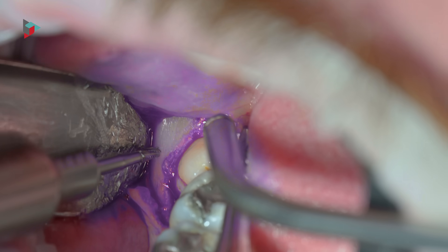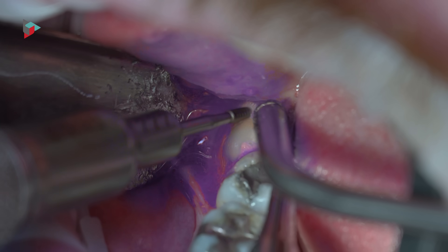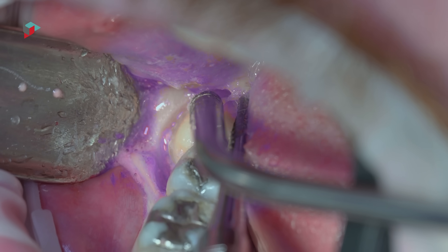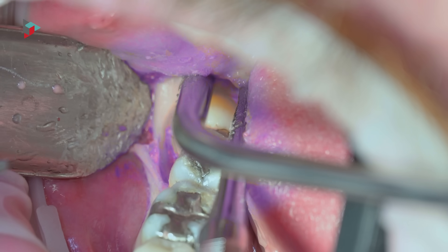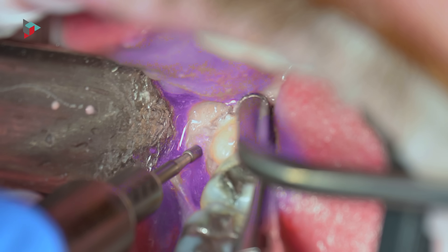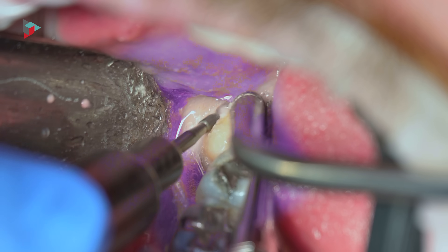Impacted teeth are seated deeper and tighter, hence requiring this next level procedure. The sectioning procedure involves cutting the tooth into smaller sections or pieces to make it easier to remove.